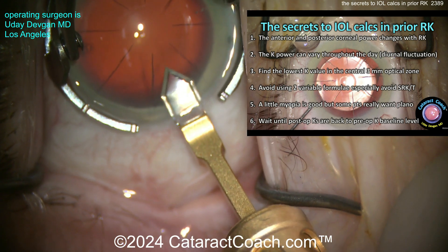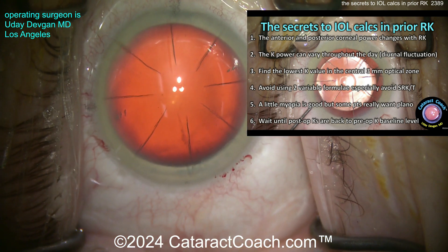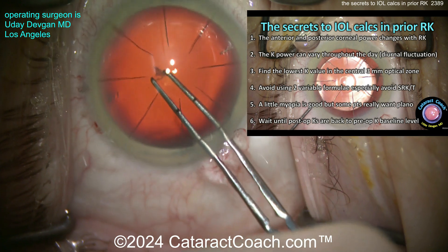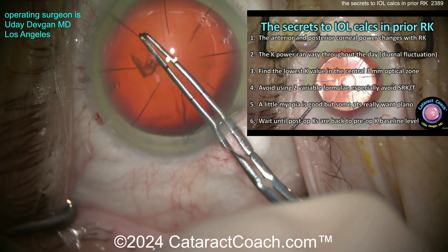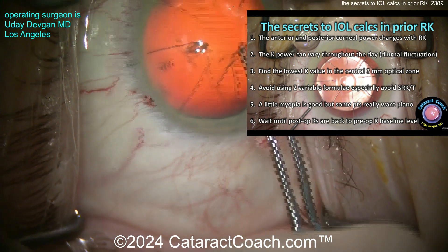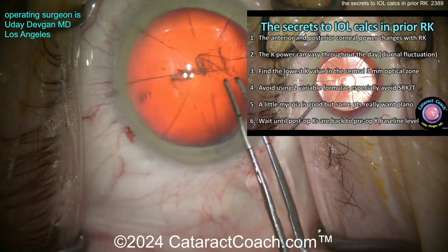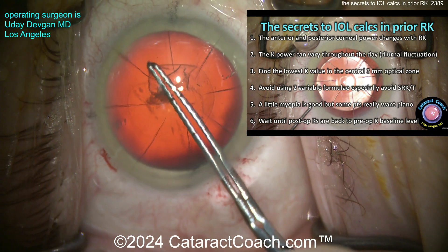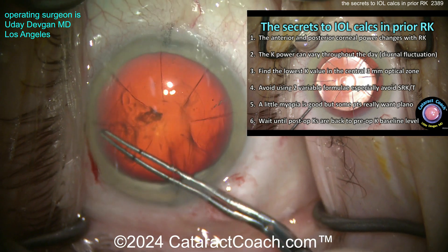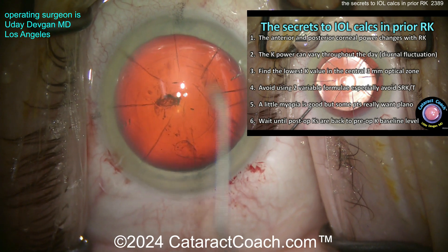Number one: remember the anterior and posterior corneal power both change with RK — that's not the case for LASIK. In a virgin eye, if the cornea measures 44 diopters, the anterior cornea might be 50 and the posterior minus 6, giving a net of 44. But in RK, the whole corneal structure changes, so in a post-RK eye, the posterior cornea may be minus 5 or even minus 4 diopters. Measure it directly using a dual Scheimpflug device like the Galilei or Pentacam.